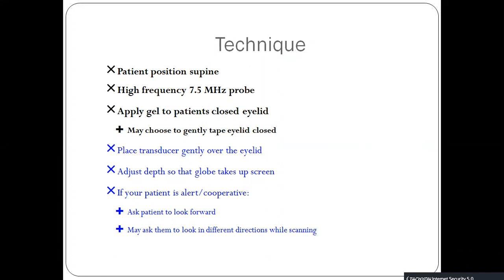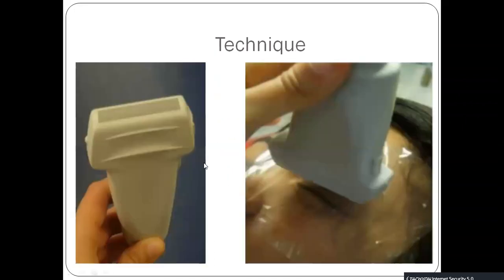If the patient is alert, communicative, or cooperative, you can ask the patient to look forward. You may also ask them to look in different directions while scanning. This is the linear or high frequency probe — you directly ask the patient to close the eyelid and then apply the ultrasound probe over the eyelid lightly.